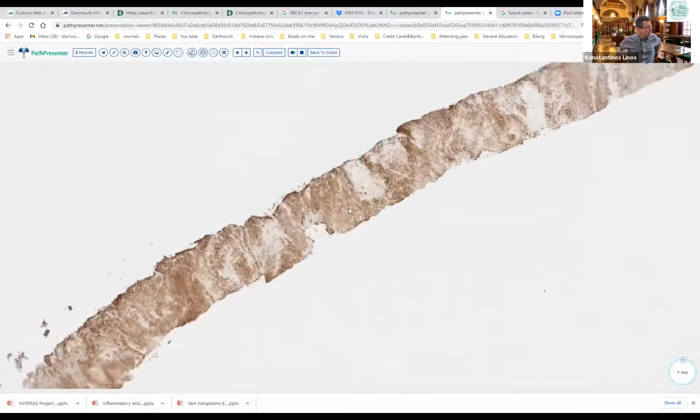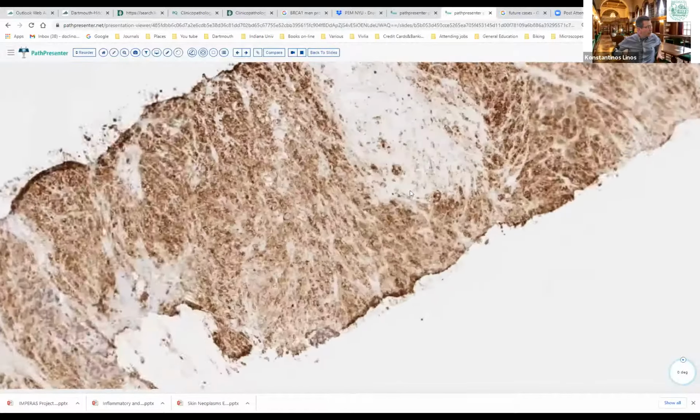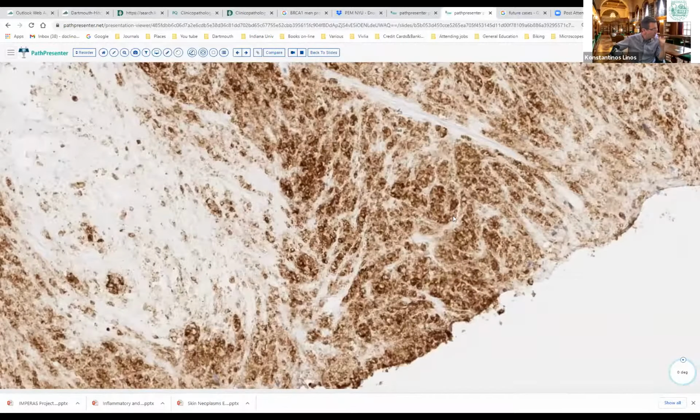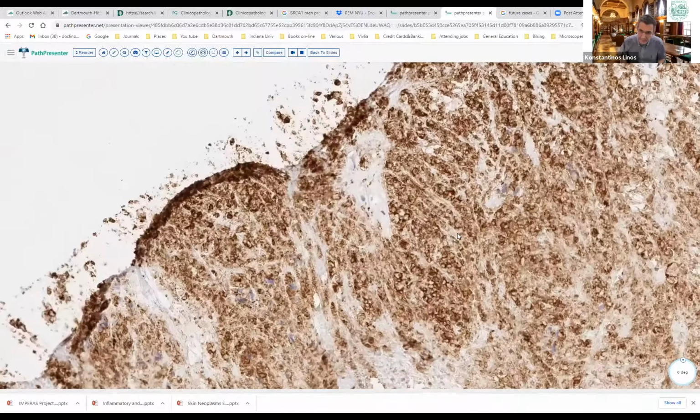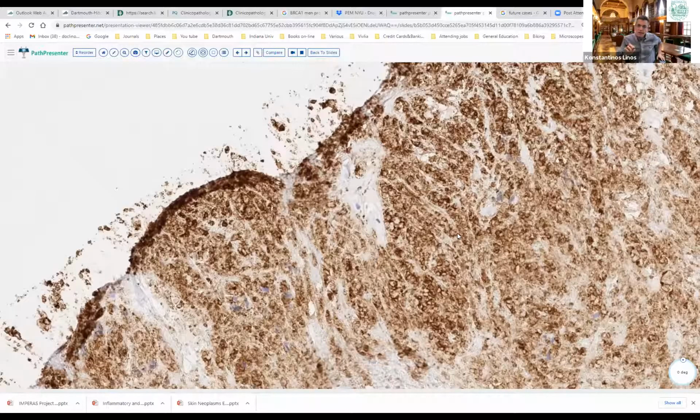And this was CD31. One other pitfall I want to tell you about CD31, I don't have a 40X here, is one of the things I learned with Sharon: CD31 can stain histiocytes, and actually significantly. I've seen a lot of cases with Sharon, and after I finished, of pleomorphic undifferentiated sarcomas that had a lot of intratumoral histiocytes, and they were brown, and people were calling them some kind of angiosarcomas. You have to have very strict criteria of what you call positive in CD31. You have to have strong membranous positivity to consider that positive.